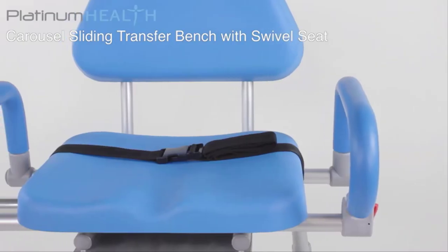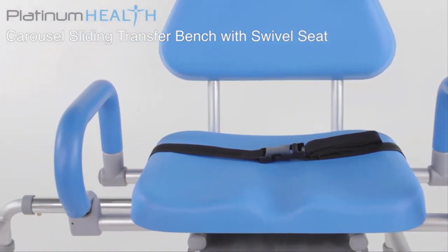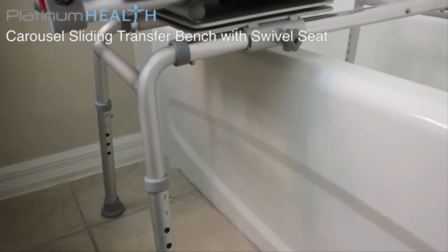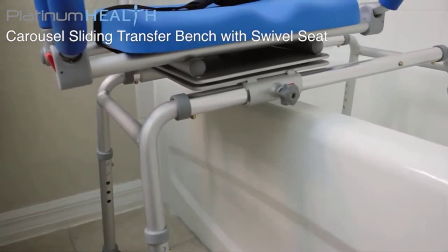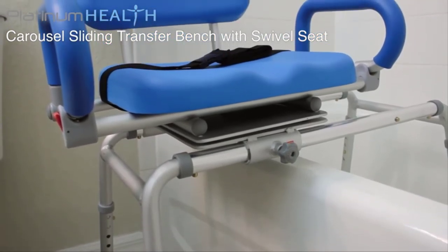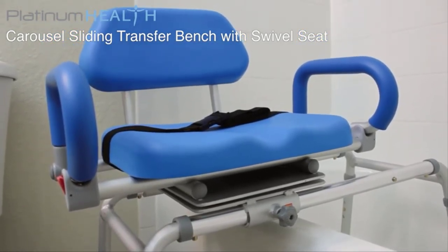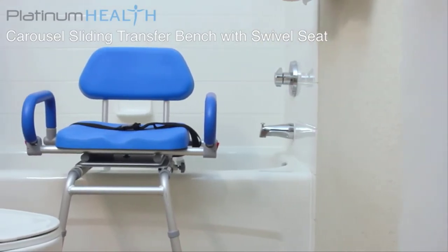Many Carousel users have indicated that the installation of the device has helped prevent them or a loved one from having to move out of their home and into a skilled nursing or assisted living facility. Others have saved thousands of dollars by investing in a Carousel instead of remodeling their bathroom or buying a walk-in tub. The Carousel is the perfect companion for anyone who wants a safe, comfortable, dignified and easy-to-use bath transfer solution.